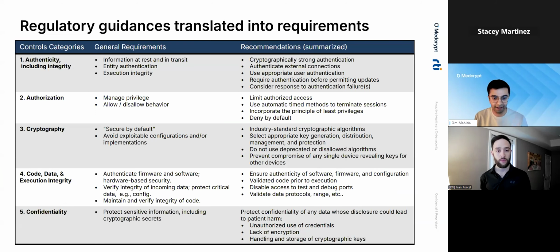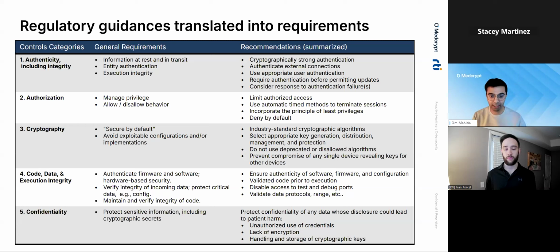Now, one could, like I have, spend an afternoon or a weekend going through all the guidances with a highlighter and trying to understand hundreds of pages of what those cybersecurity requirements actually mean. We've distilled some of them into a few key control categories. So when we talk about the cybersecurity requirements that are being pushed by regulatory agencies like the FDA and others around the world, at least when it comes to data communication and device communication, what we really mean is securing data at rest and in transit.